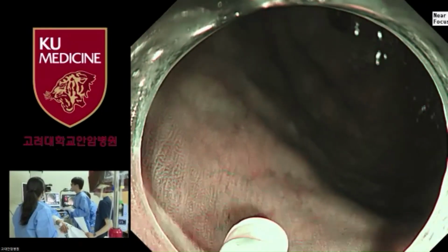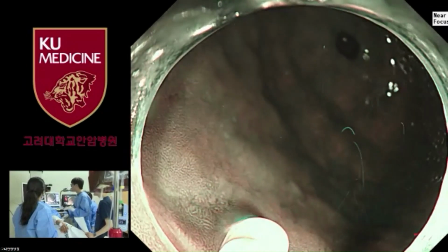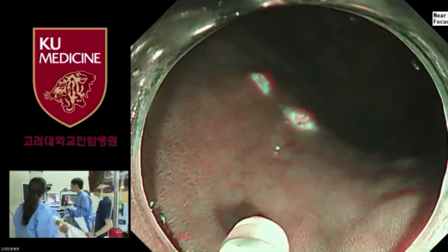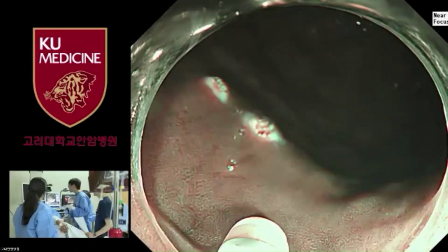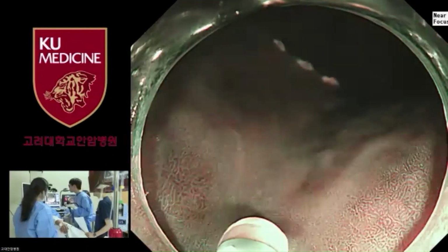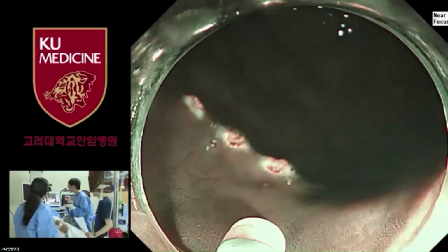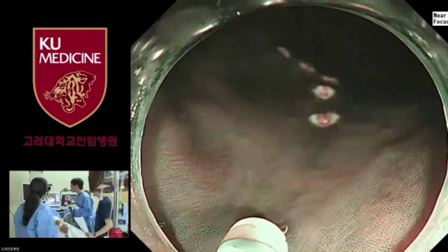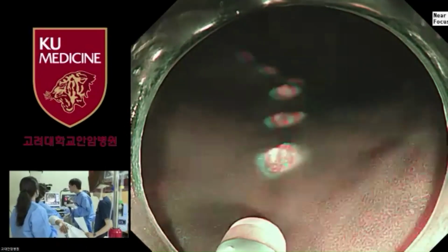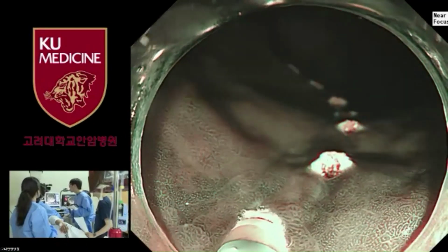So we have to observe the mucosal surface thoroughly with the near focus or the magnifying scope, and then we need to check which side is the neoplastic lesion. So I think maybe 2 centimeters in length and 1.5 centimeters in width would be the size of the lesion.